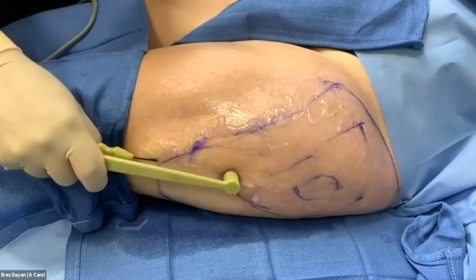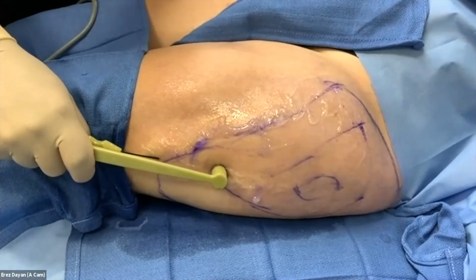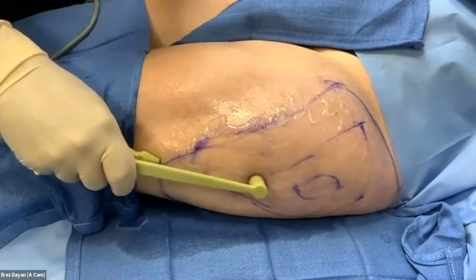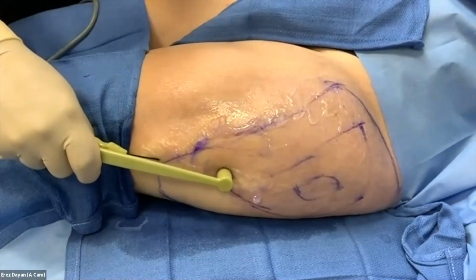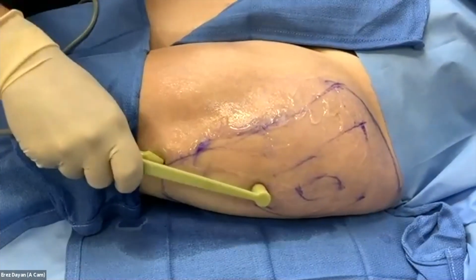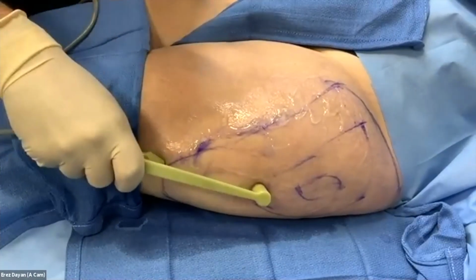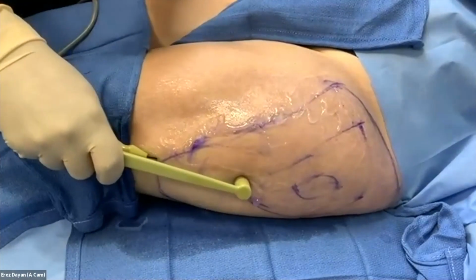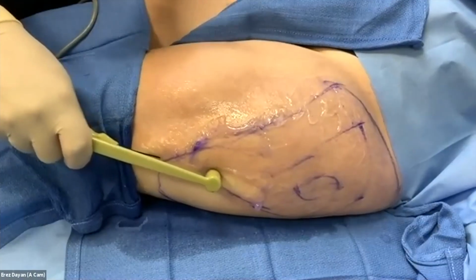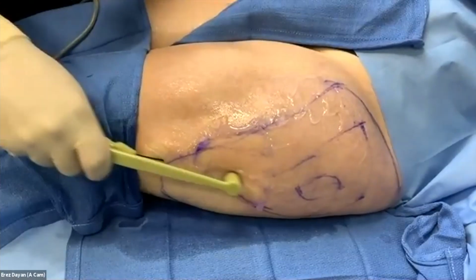The temperature is important, but your depth is more important because the radio frequency energy is really only transmitting half the distance between the two electrodes. So as long as the internal cannula is deep, you're safe. If it's superficial, then even at a lower temperature, you can have a problem. Now, if you do get a burn, which is quite rare, honestly, what'll happen is you'll see a little cigarette butt-sized epidermolysis. And what I usually do if that happens is just excise it and treat it like a lipoma and move on, because otherwise it'll evolve and you'll be nursing it and it'll just not be ideal.